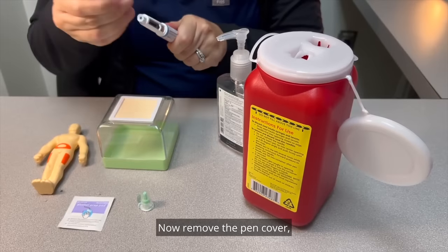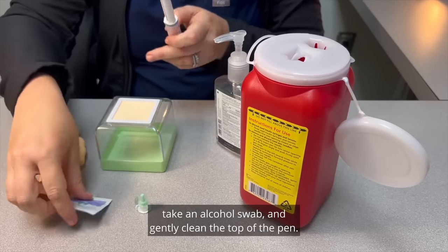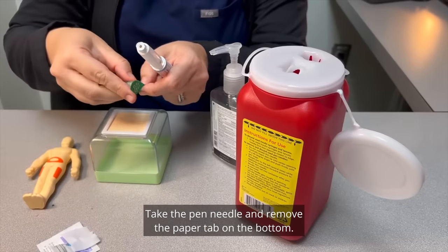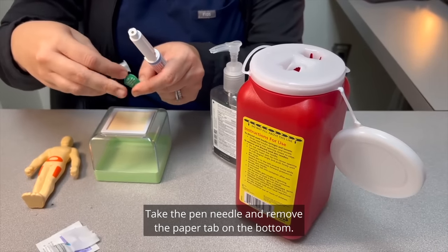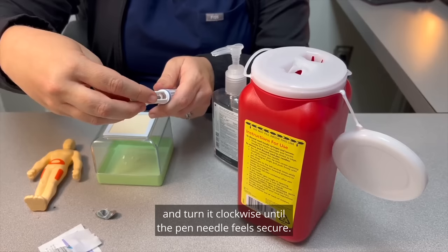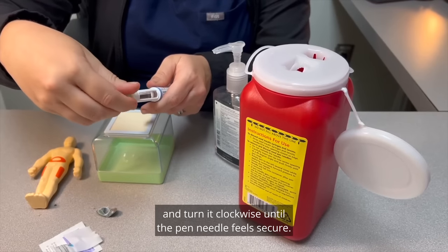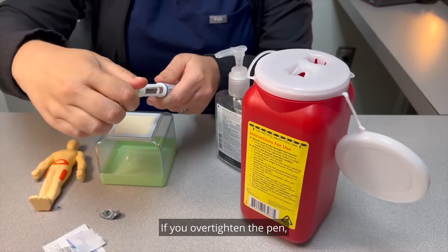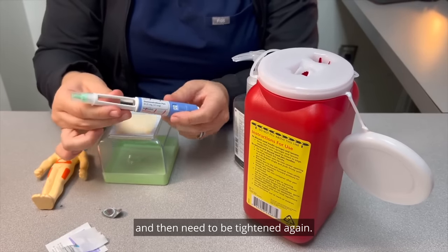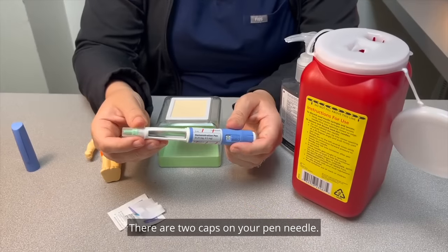Now remove the pen cover, take an alcohol swab, and gently clean the top of the pen. Take the pen needle and remove the paper tab on the bottom. Place the pen needle on top of the pen and turn it clockwise until the pen needle feels secure. If you over-tighten the pen, it may need to be loosened and then tightened again. There are two caps on your pen needle.